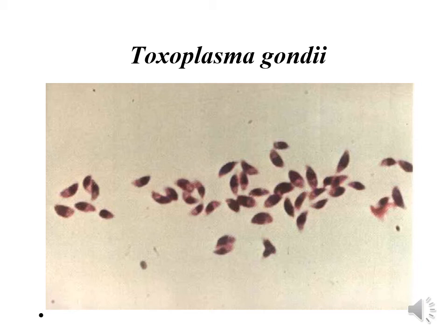Toxoplasma gondii usually is a very important infection during pregnancy, and it is more dangerous if it is an infection at the early months or days of pregnancy. It can lead to abortion and other malformations, for example, stillbirth, brain involvement, etc. The parasite recovered is usually very simple, somewhat oval or crescent in structure. The central part is more or less just showing a dark, large nucleus.